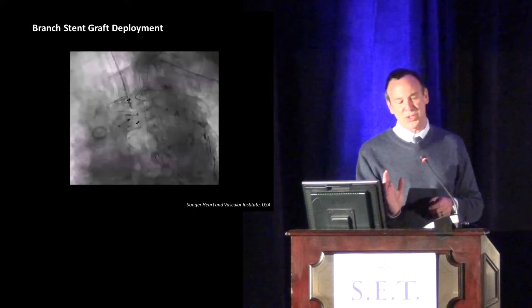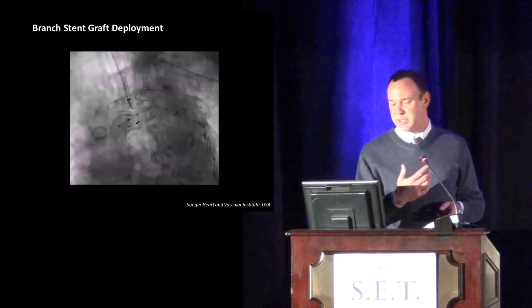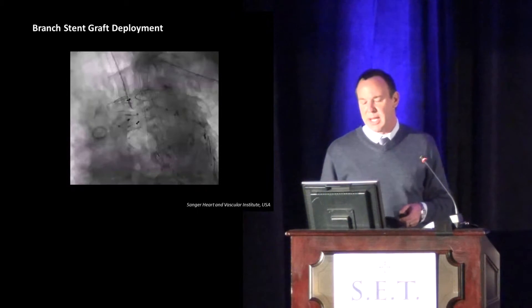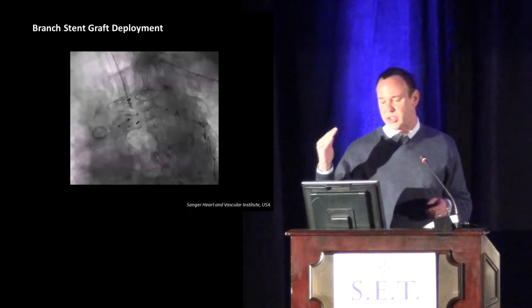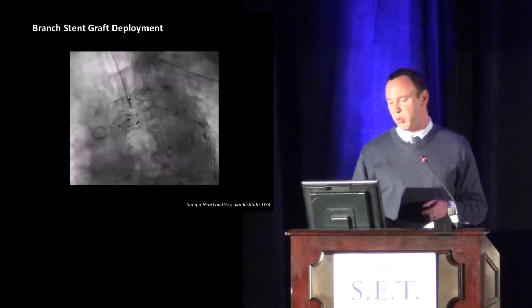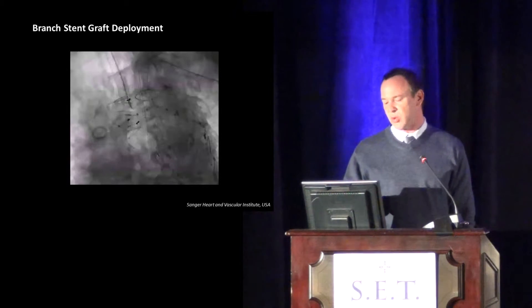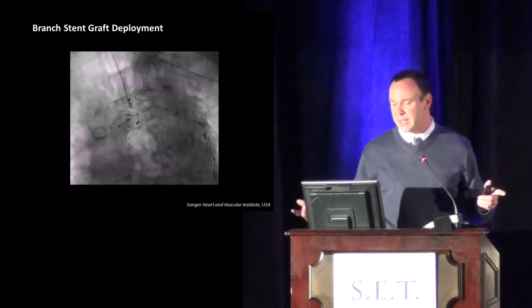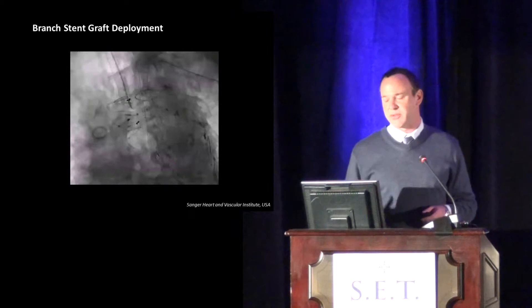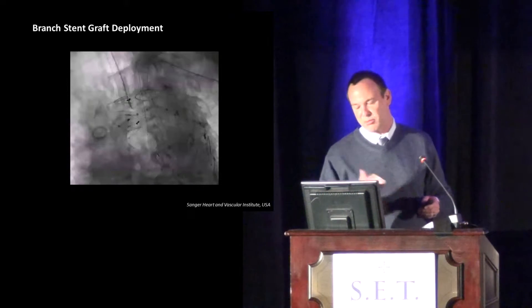This is the main branch graft coming up through the arch. One of the nice things is when you bring this device up, it actually moves that volcano up a little bit more. We typically will shoot a retrograde to see where that vertebral is. Because this device has a lot of radial force, it has a tendency to want to jump, so very slow deployment is important. You want these distal markers to be below the base of that ring. The nose cone of that branch graft is quite long and has a tendency to go way out on the left subclavian. It tracks very nicely, but if your sheath is up there shooting a retrograde, you've got to make sure you pull that sheath back so you don't push it out of the arm.